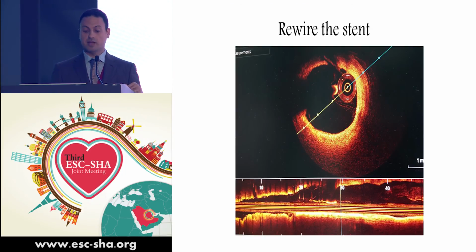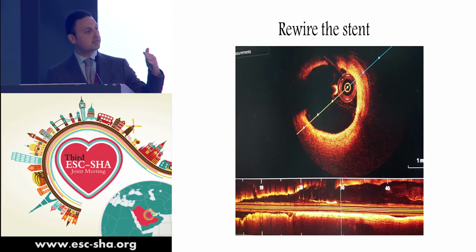Another rewiring, and then repeat the OCT, and still my catheter, you can see here the catheter is outside part of the stent. And this is very good for the OCT that tells how low profile is this catheter. I can go behind the stent, through the struts, and then going down in the vessel.